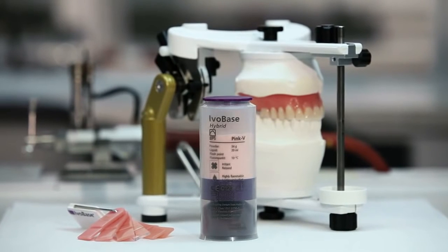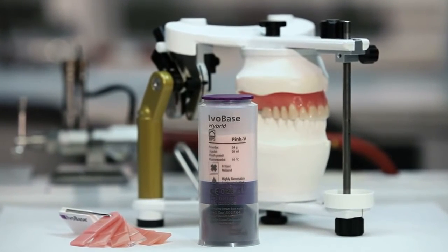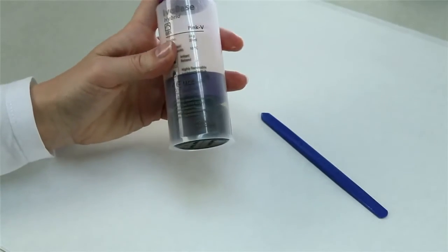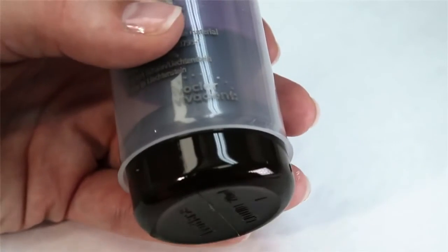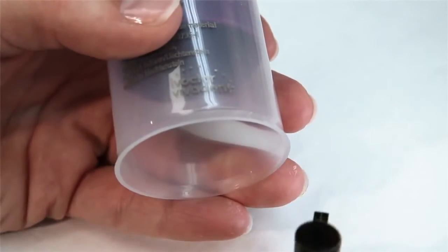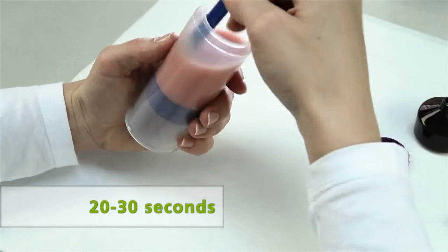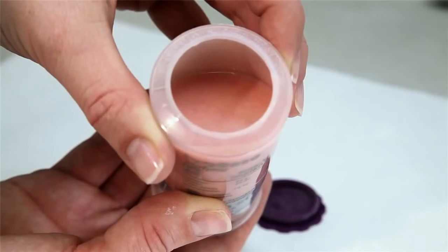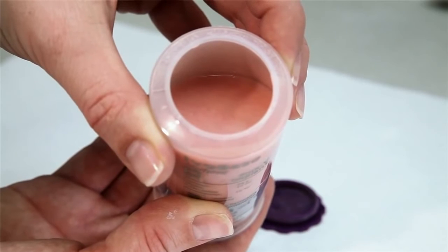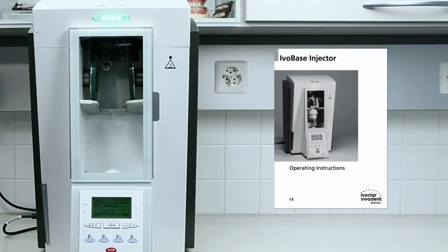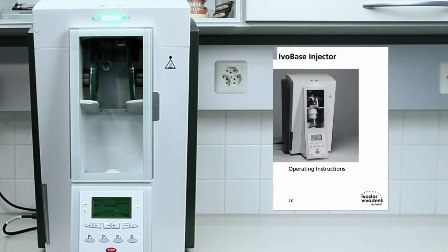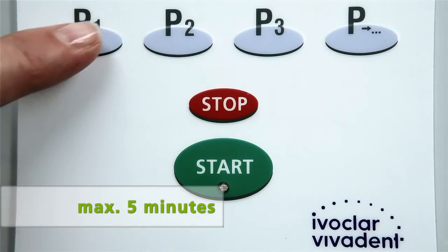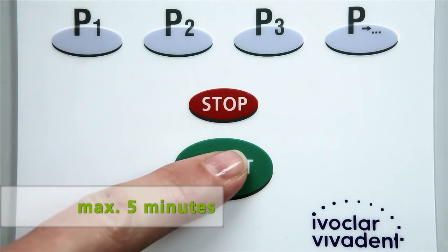One capsule is sufficient for the injection of a maxillary or mandibular complete denture. A short blast of compressed air between the monomer container and the capsule renders the monomer container easy to remove from the capsule. Use the spatula to mix the monomer and polymer to a homogenous mixture for approximately 20 to 30 seconds. Make sure that the material is thoroughly mixed. The operation of the IvoBase injector is described in detail in the corresponding operating instructions. No more than 5 minutes should pass between mixing the material and the start of the polymerization program.